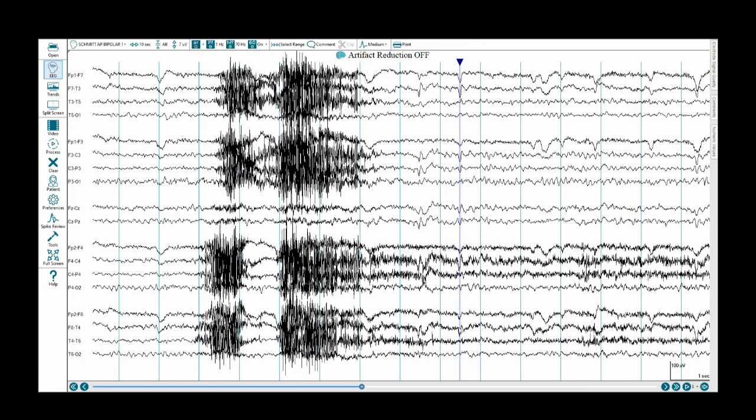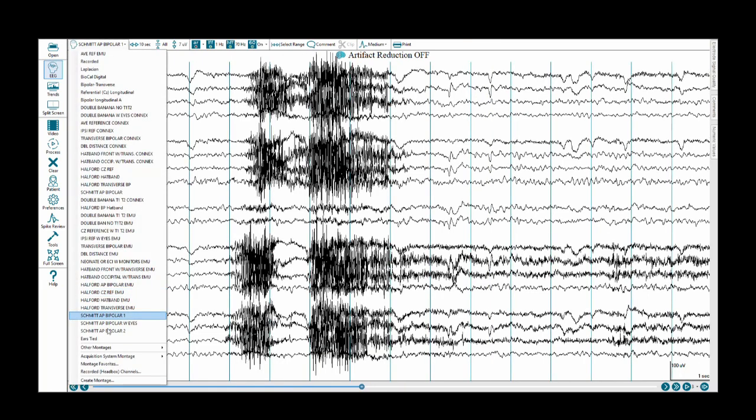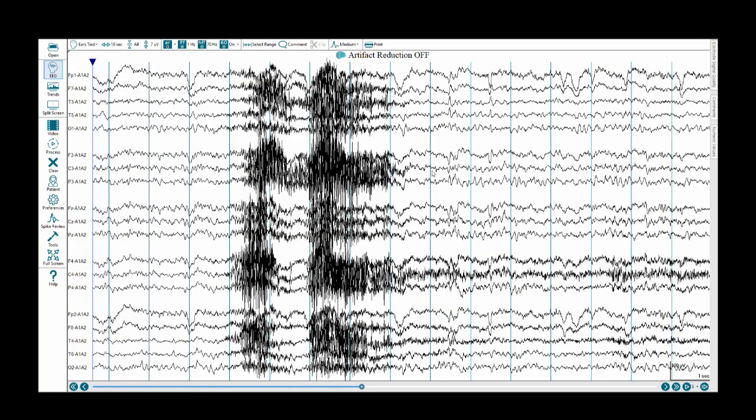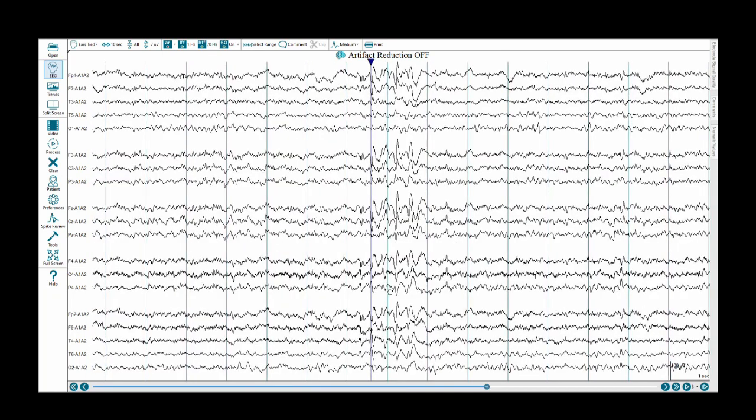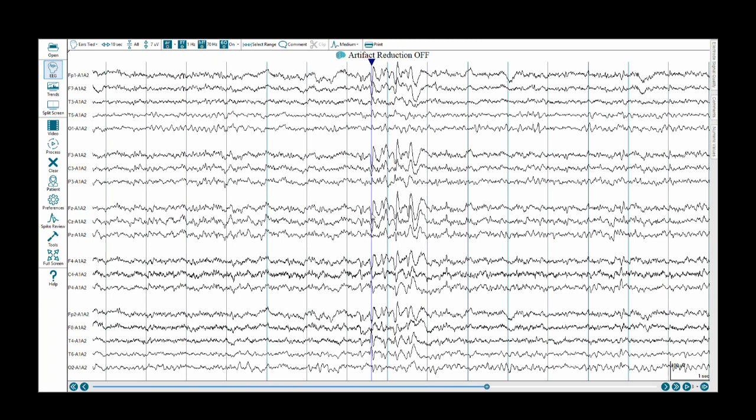Over the right, the complicit electrode is T4. Over the left, the complicit electrode is F7, although they look very similar. We can make more sense of this if we go to a referential montage. So here's a great example. This looks like three or so discharges in rapid succession. T6, T4, as well as C4 and P4 are involved in this discharge.